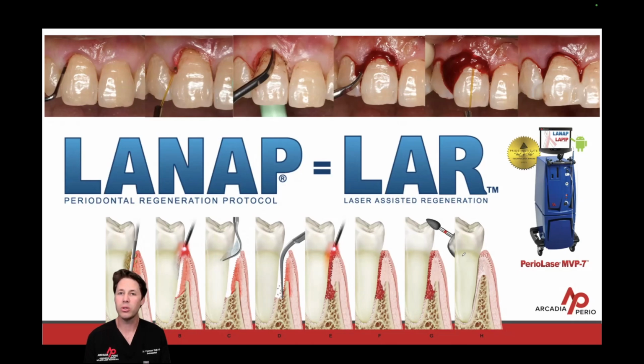Step G, occlusal adjustment: remove any non-working interferences and prematurities. And in step H, we're going to allow things to heal for 6 months and watch that laser-generated blood clot become bone.